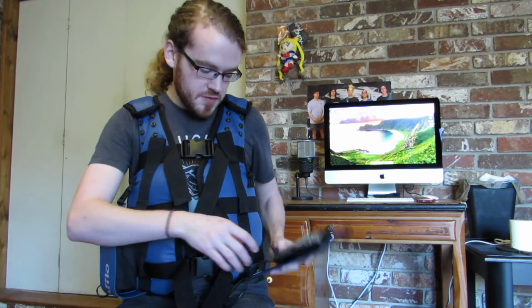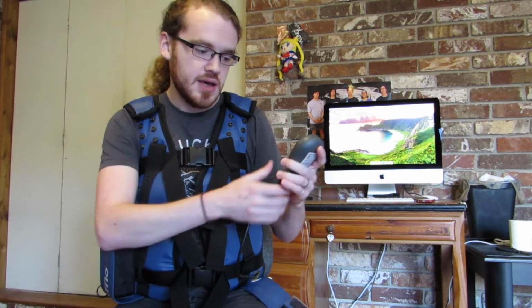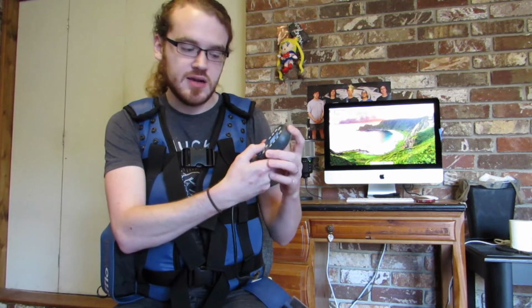Okay, so I'm over here. I've got the remote obviously turned on from a moment ago. And all you're going to do is pick your settings, and there's a little play button right here in the middle. You just hit play, and you're going. I'm not even sure how well you'll be able to hear that on the camera, but this is a very quiet vest. The Hill-Rom vest was just obnoxiously loud. You had that constant sound going on, whereas this is just kind of a subtle buzz.